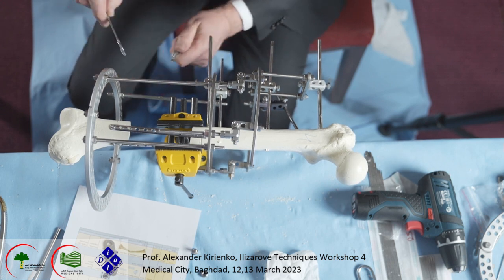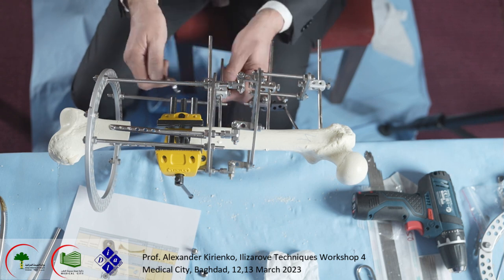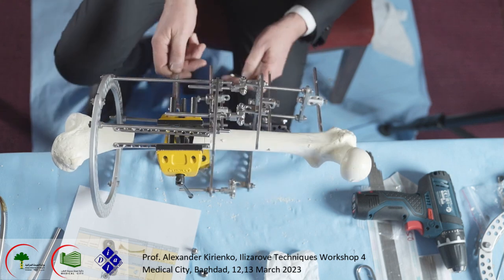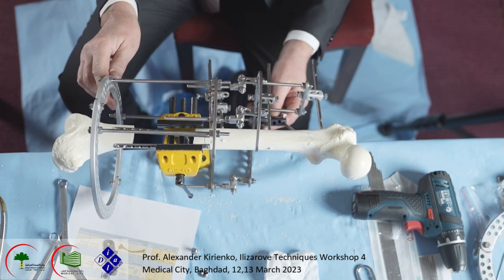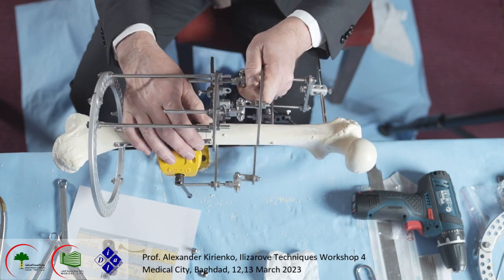Later we put another one posterior, but for now it's not possible for our system of fixation. Practically, we did this temporarily, and now we should fix the distal femur.